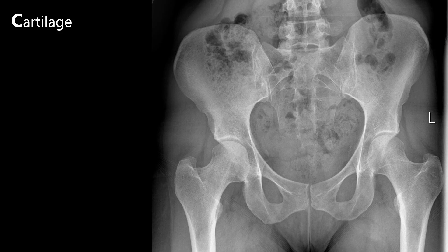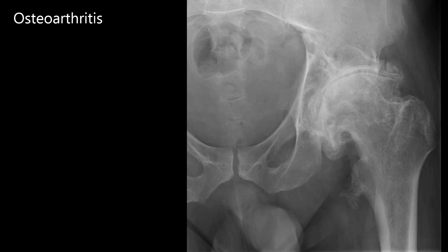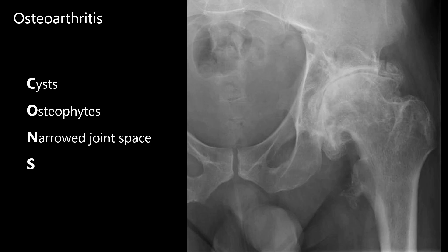Next is cartilage. There are three cartilage containing joints that we need to assess: the acetabular joint, pubic symphysis and sacroiliac joints. Whilst inspecting these, we are looking for any signs of arthritis or dislocation. This patient has severe osteoarthritis in their left acetabular joint. There are four osteoarthritis signs that can be remembered using the mnemonic CONS: cysts, which are fluid filled sacs sometimes found in the femoral head; osteophytes, which are small bony growths; narrowing of the joint space, which should be 3-5mm in a healthy adult hip joint; and subchondral sclerosis, which is where the bone underneath the cartilage increases in density. All four of these signs can be seen in this x-ray.